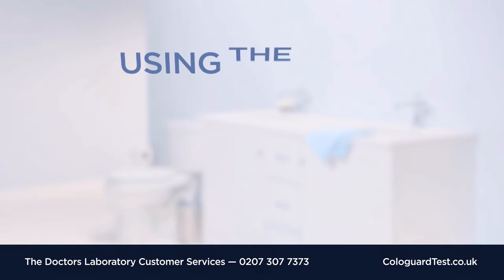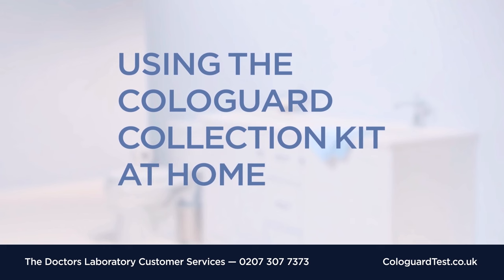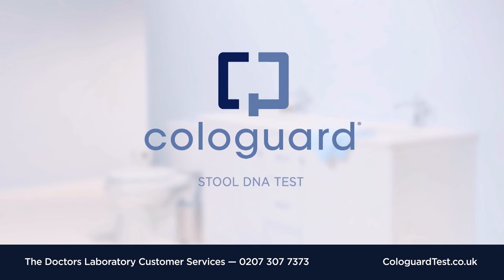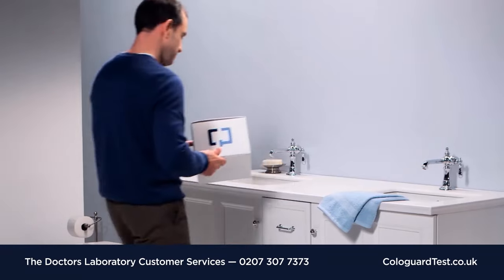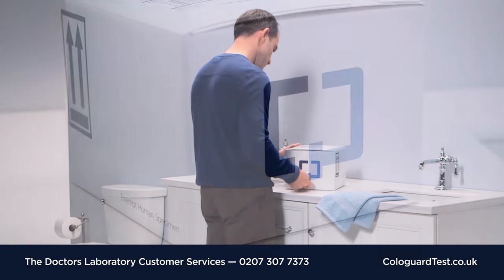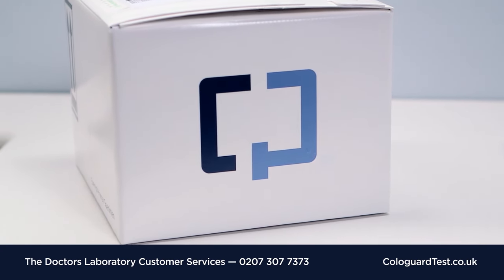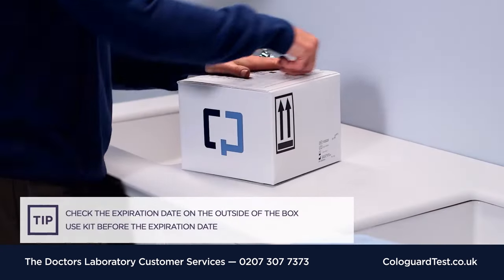Now that your doctor has ordered Cologuard for you, this video will show you how to use the collection kit. Cologuard is a screening test that uses a stool sample, a bowel movement, to find bowel cancer and precancer. Use this kit to collect your sample, then send it to the lab using the instructions provided. Your doctor will contact you with the test results.